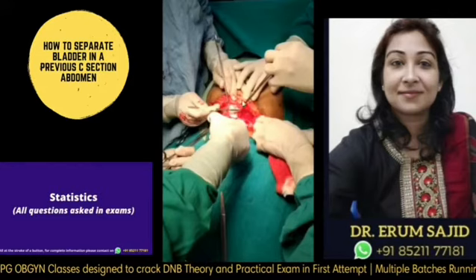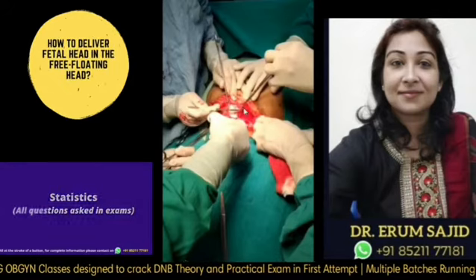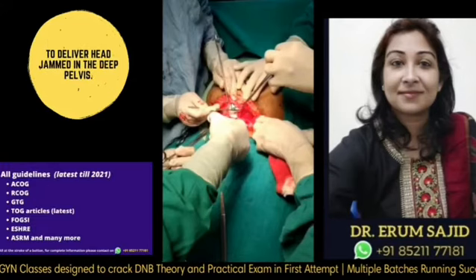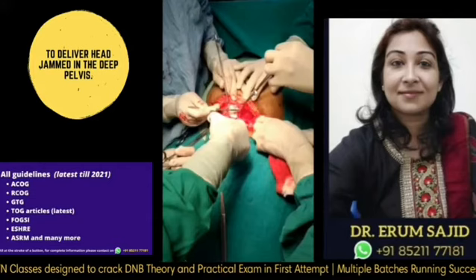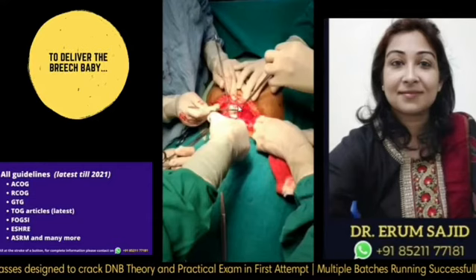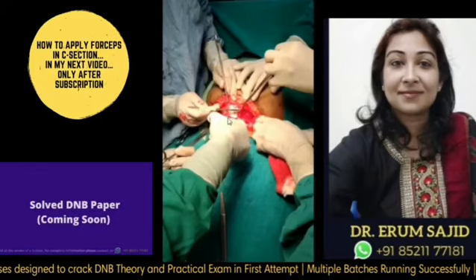What I'm doing over here is that my actual work is being done by these two Allis forceps, which are pulling this fascia up. So they will do the blunt dissection. The pulling force will give a shearing force, and the shearing effect will probably make the space which I want over here.